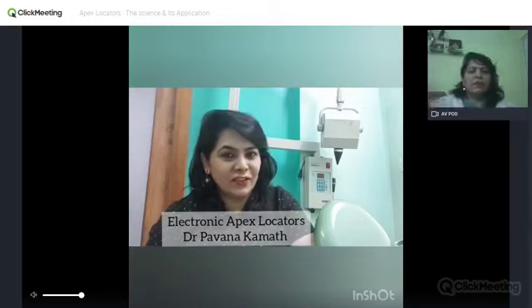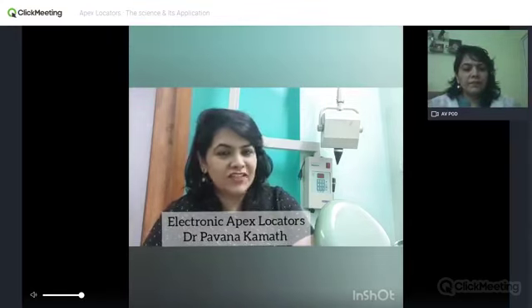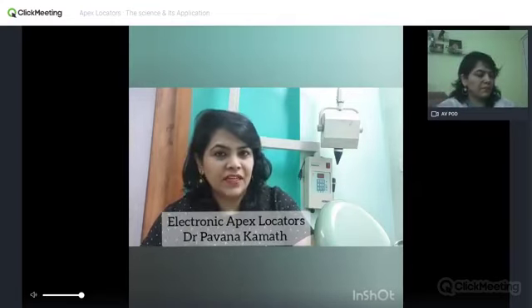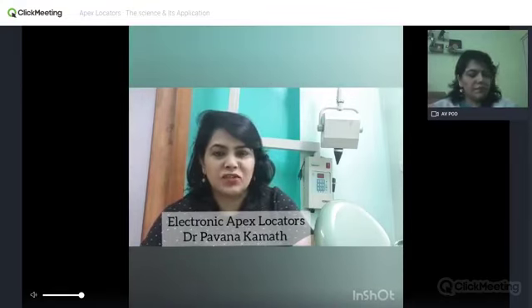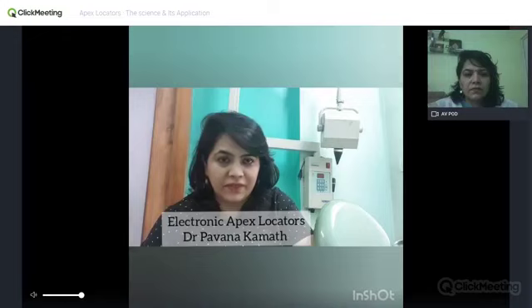Welcome everyone to the session on electronic Apex locators and their applications in determining the working length in the root canal system. For starters, the very terminology Apex locators is a misnomer. They are to be called and addressed as electronic root canal length measuring instruments to be appropriate.